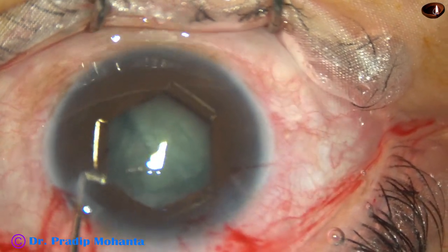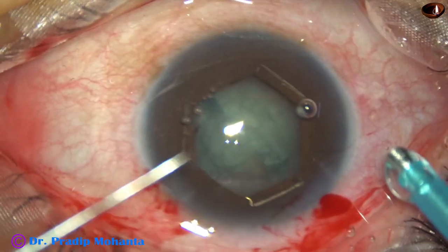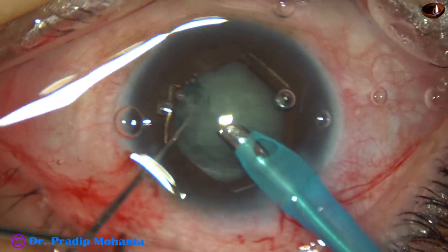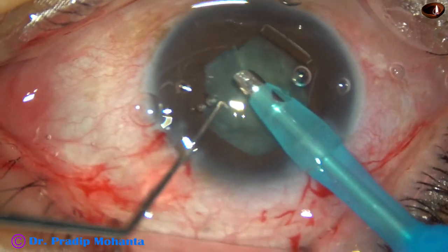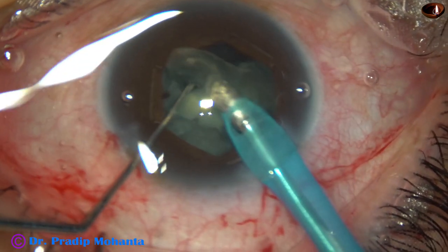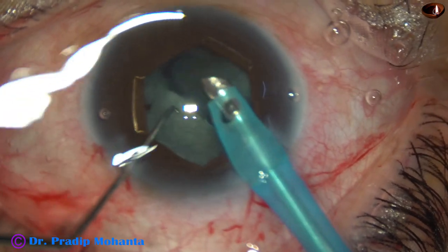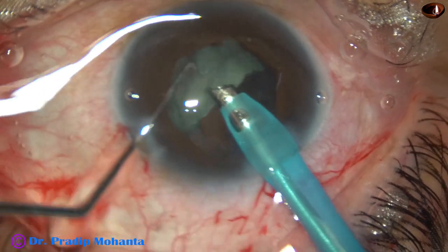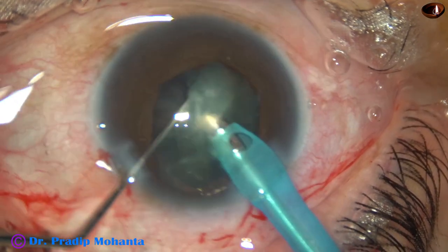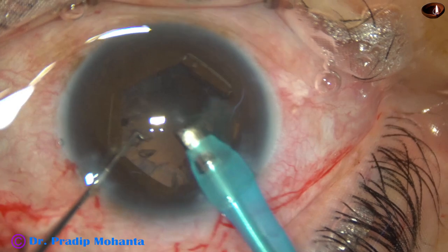Management of this nucleus will be very easy. It is not necessary to subdivide the hemi-nuclei, but one can do that. See how easily the hemi-nucleus is managed — this hemi-nucleus stands and is emulsified. Followability of the lens mass is very good and we can easily manage the hemi-nucleus. This is the other hemi-nucleus — it is also done.